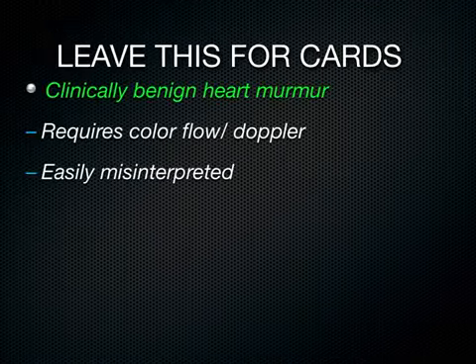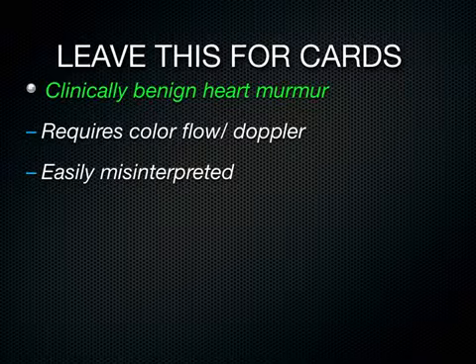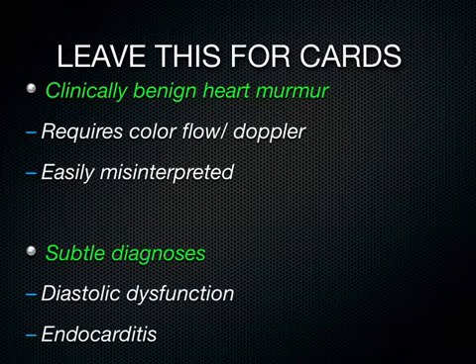But there's stuff we're going to leave to cardiologists, like a heart murmur. You come out of the room and go, hey, the patient's got a heart murmur, want to go look at it? Yeah, I'm a little curious, as any doctor would be, to see what the murmur looks like. But differentiating how much TR or MR, 1+ or 2+, has no clinical bearing for me as an emergency physician, and it's easy to misinterpret those color flows across the valves. Other things like early diastolic dysfunction and endocarditis, I've hallucinated hundreds of times now. Just stay away from that stuff unless it's super obvious.